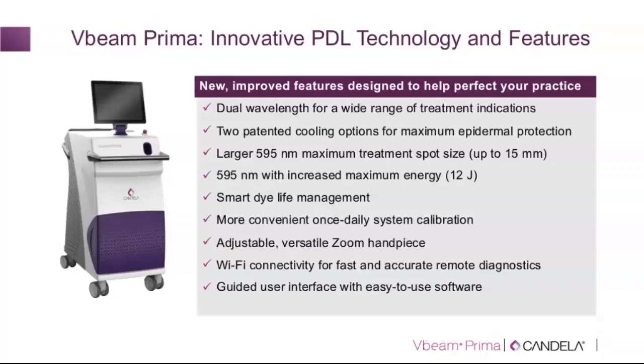Once again, with the contact cooling, you are able to adjust the degree of cooling that you would want. So you are able to choose the degree of temperature and cooling that you would want the epidermis to be. Particularly useful when you're using the Nd:YAG at higher fluences, the contact cooling will also allow you, for example, to have perhaps some slightly longer contact afterwards, to be able to cool the skin for a little longer.